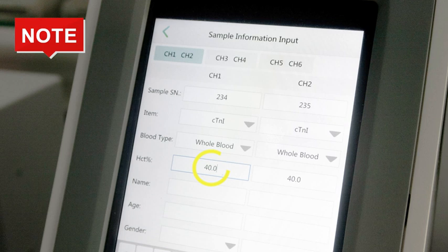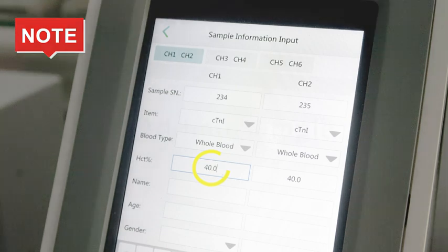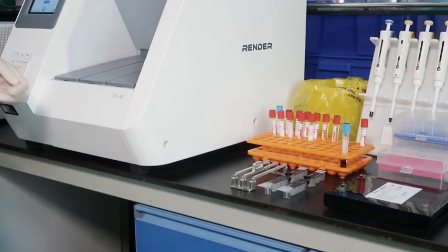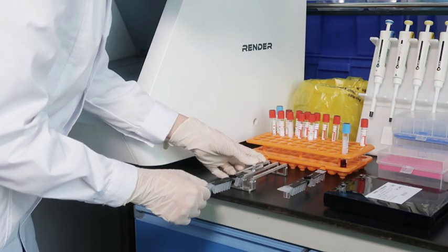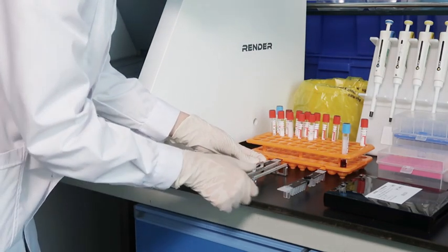Third, adding sample. First, load the reagent cartridge into the cartridge holder and push it in place.